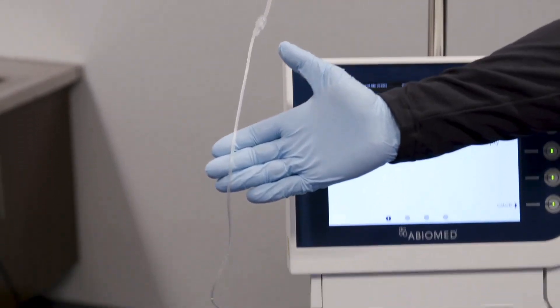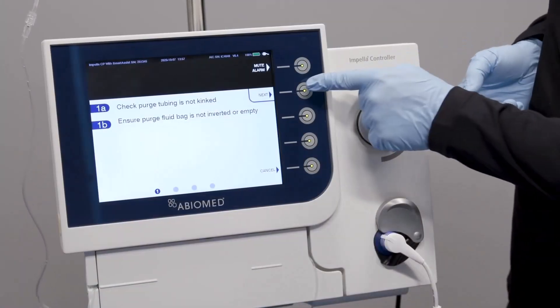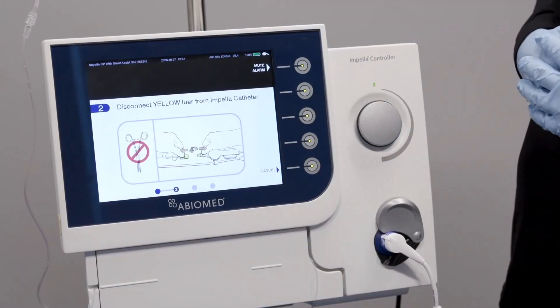Ensure that the purge tubing is not kinked, or that the purge fluid bag is not inverted or empty. Once verified, press the next soft button to continue.